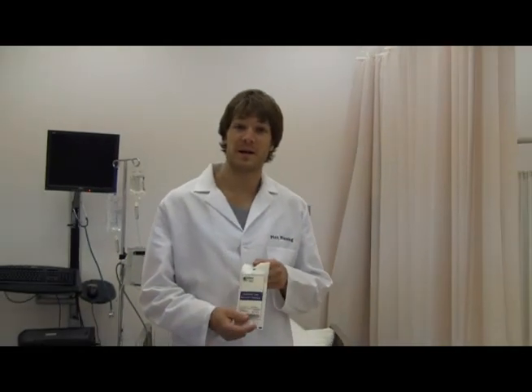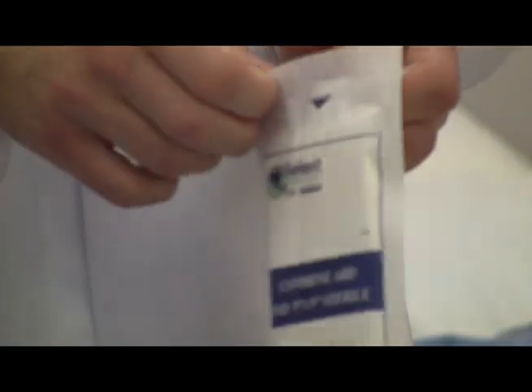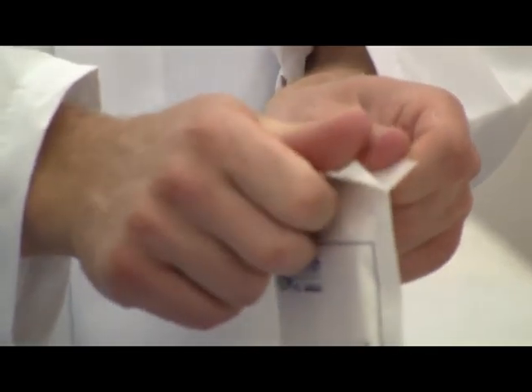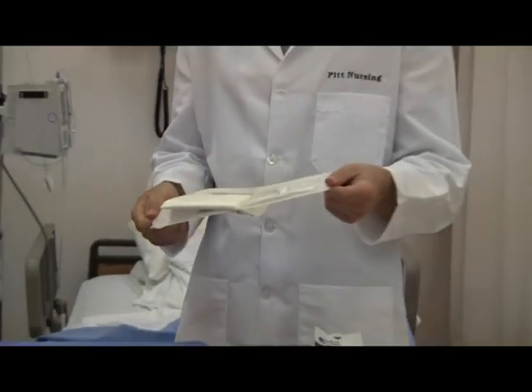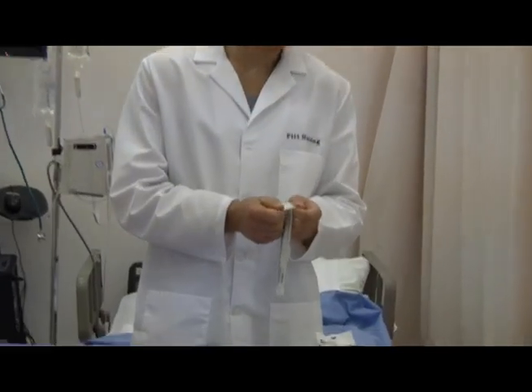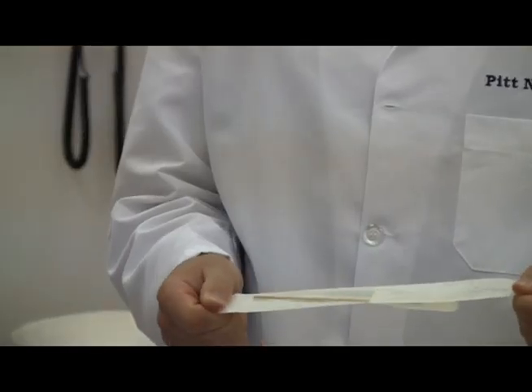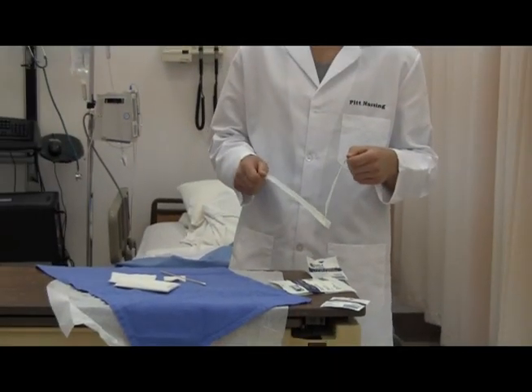Okay, now we're going to practice with our ABD. Opens from the top. Take your two thumbs, gently pull apart, and into the sterile field. By the way, ABD stands for Army Battle Dressing. Okay, the last thing we have to practice with is the Q-tip. Same thing from the top, gently pull apart, and onto the sterile field.